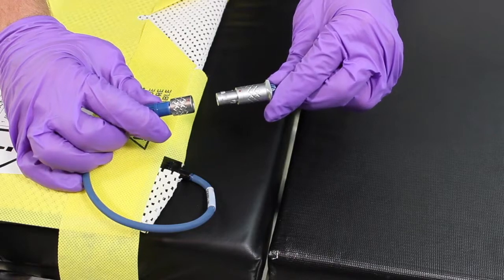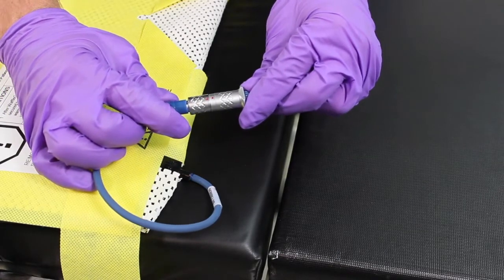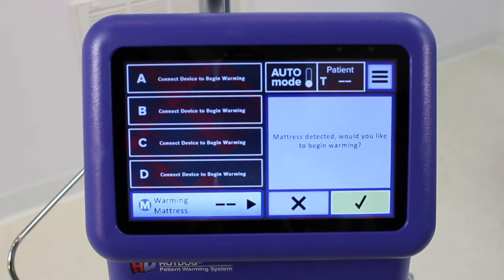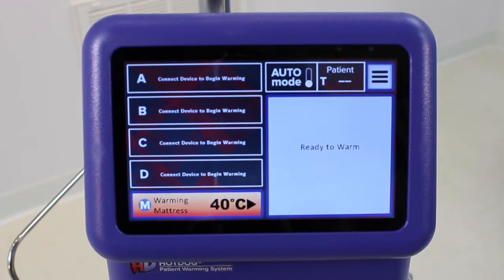Connect the blue power entry cable from the warming mattress to the connector on the blue cable from the controller. Align the red dot on each cable and push together — do not twist. Once the mattress is connected, set the temperature on the M port to 40 degrees Celsius, the maximum temperature. The system is now ready for the patient.